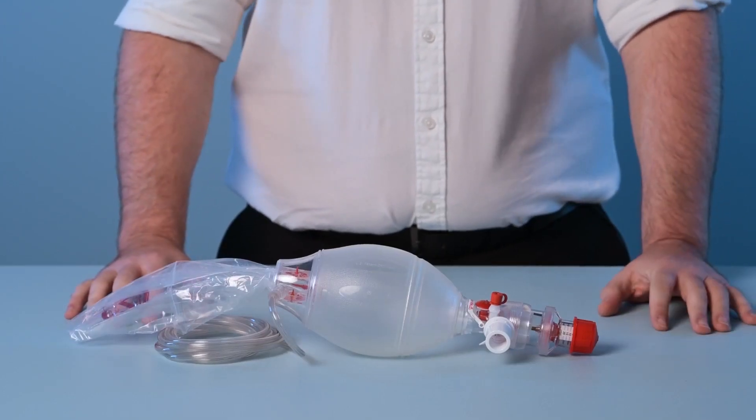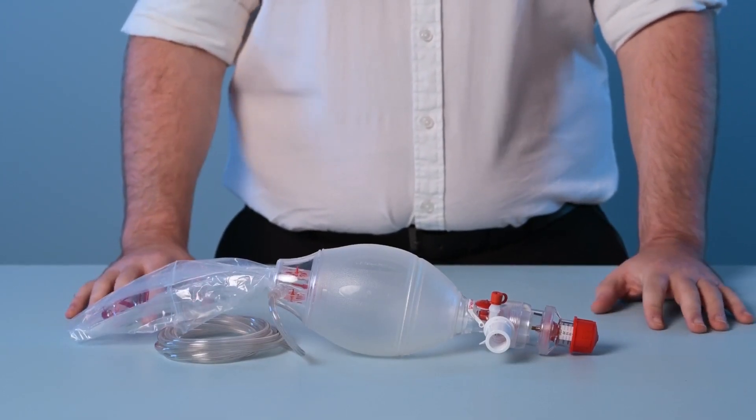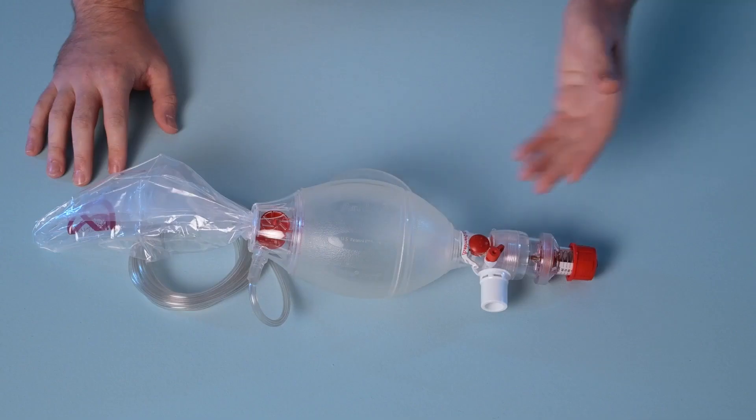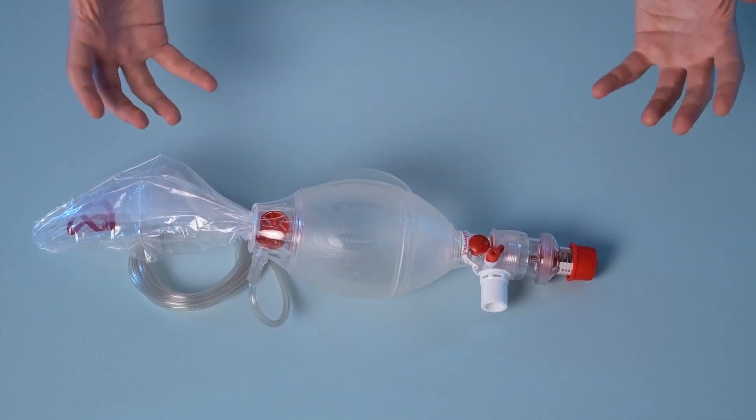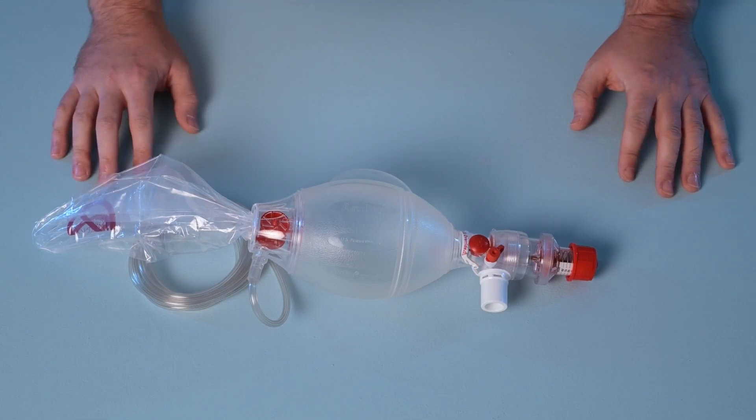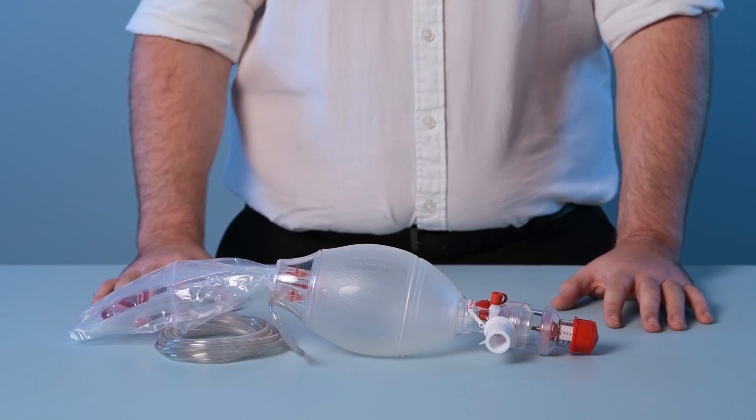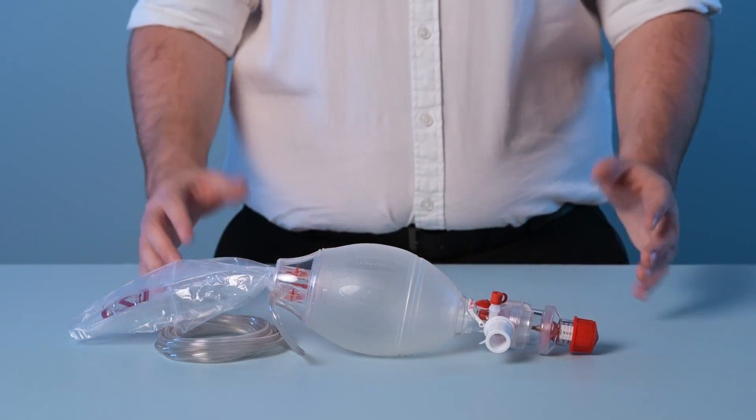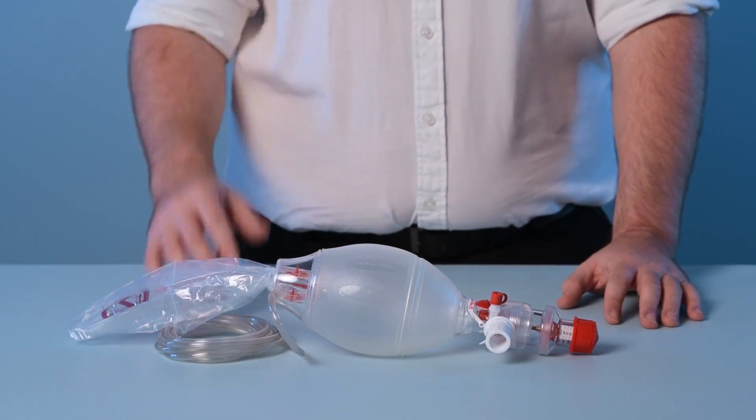Each Spur2 device comes equipped with a pressure limiting valve system, also known as a pop-off valve. The purpose of this valve system is to prevent the delivery of excessive pressures to the patient. Higher than suitable pressures have the potential to cause barotrauma which is hazardous and must always be avoided.